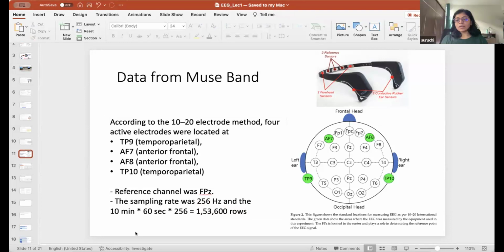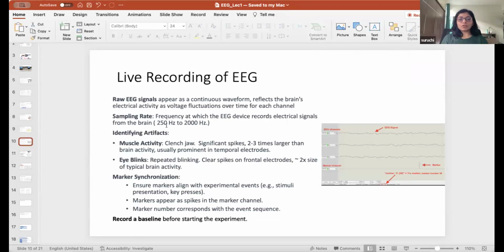It is the rate at which your device is collecting data. And in our case, it is not fixed. We can set something from 250 to 2000. I think the default would be 2000. Just check. So it is like what, 250 hertz in 1 second. Yeah. If you say 250 hertz, it means 250 samples in 1 second. Okay, 250 samples of measurement.